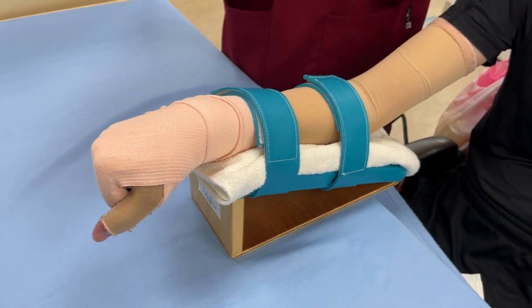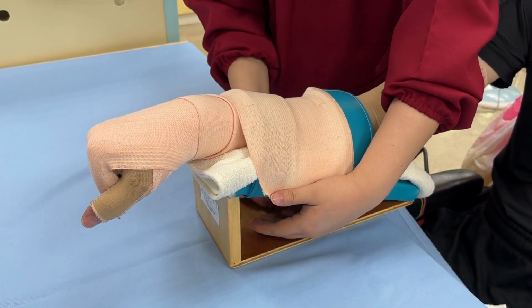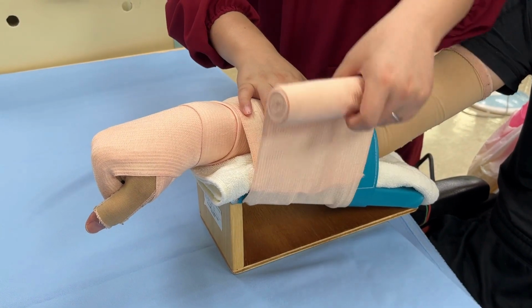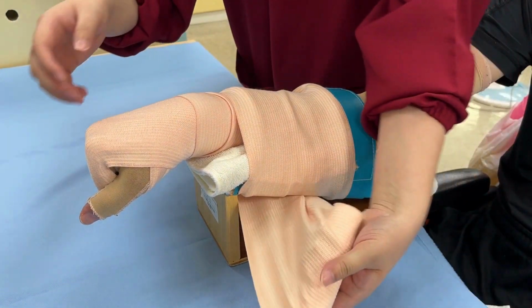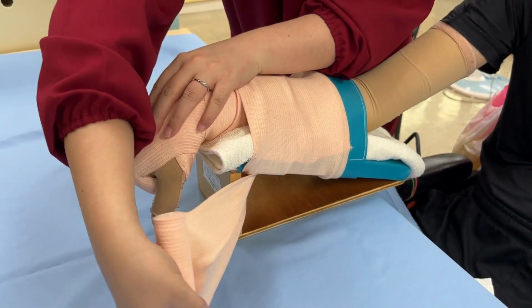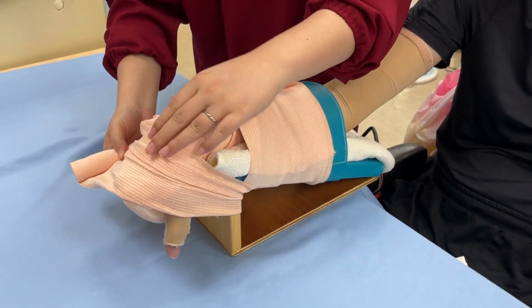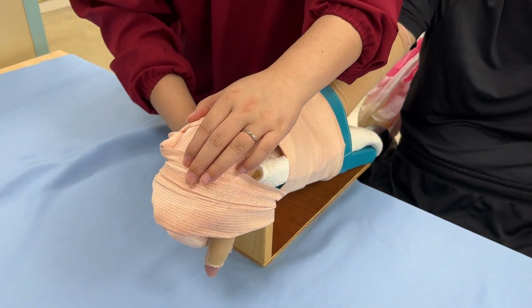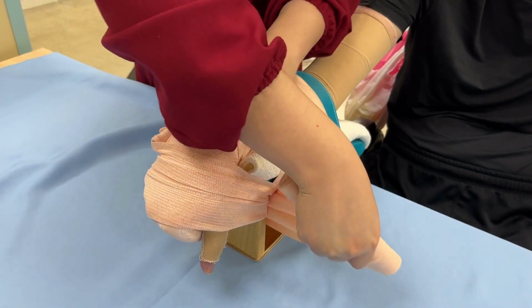Use a triangular wedge upon which the hand and forearm can be strapped. Place the wrist over the edge of the wedge, so that the hand can drop and perform wrist flexion unimpeded. After the forearm is secured to the wedge with the two straps, gently wrap the elastic bandage around the forearm twice. At this time, the elastic bandage does not need to be overstretched or generate excessive pressure.